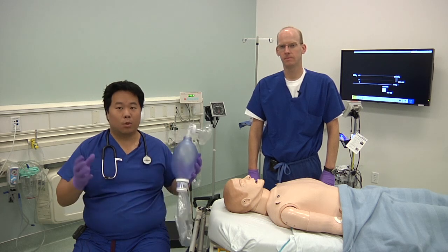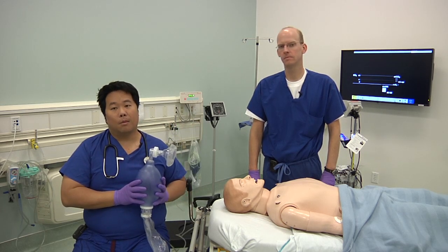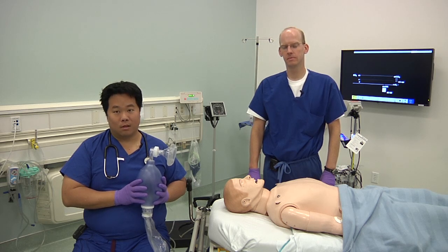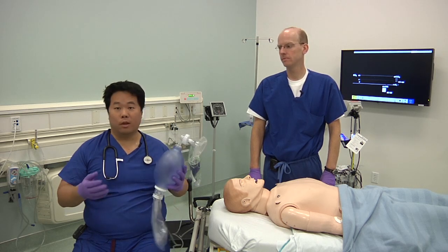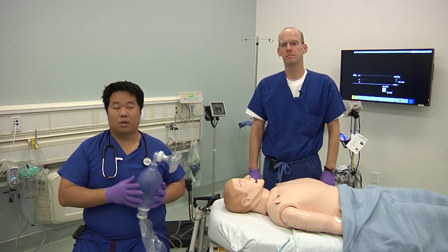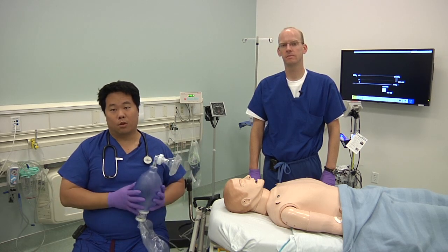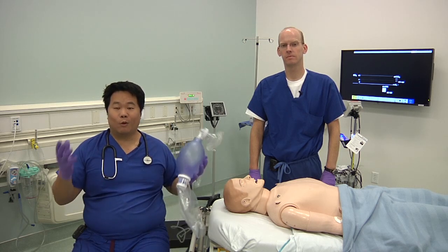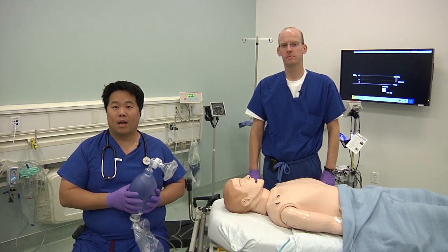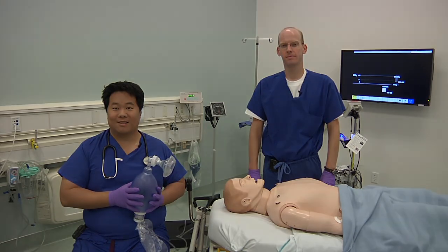And in this module, we're not only going to learn about airway management, but we're also going to learn about access, whether that's intravenous access or even intraosseous access to the patient, which is also very important during a crisis because, of course, that's the way that you give most of your drugs. So let's get started. Let's take a look at how you can handle airway management in a non-crisis situation.